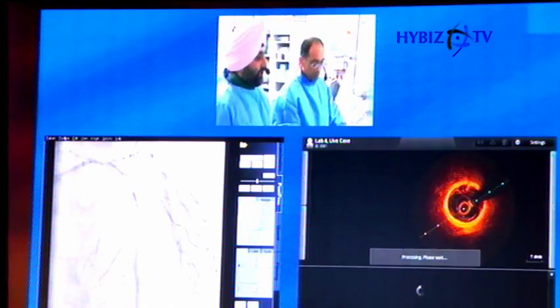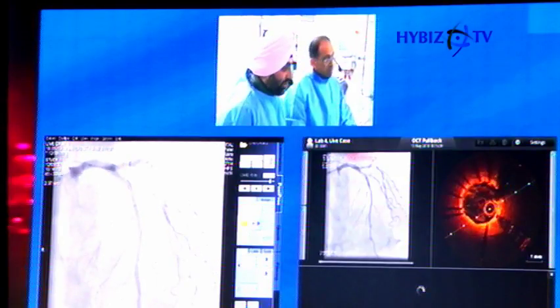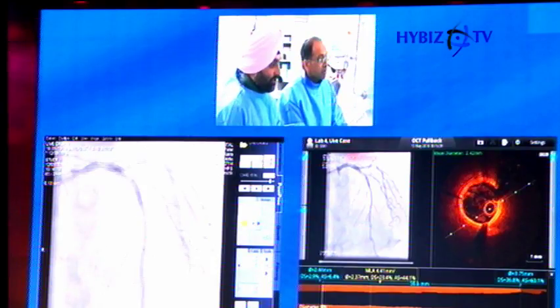What I'm going to do is just calibrate this whilst Devon talks about what else we've done with this so far and about the appearance of that diagonal. And then I'm going to go through the OCT live, and we'll look if we need to postdilate any further. We need to look at apposition and expansion. So we can confirm the pressure that we've been with the 3.5 balloon.